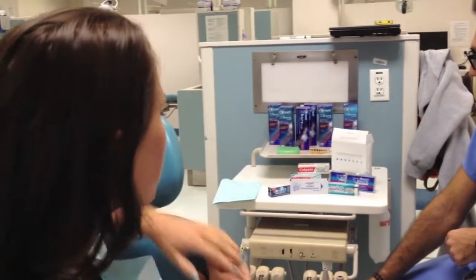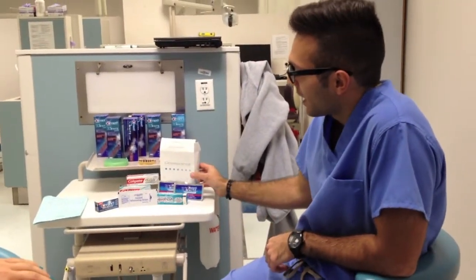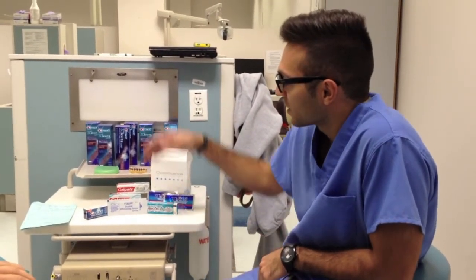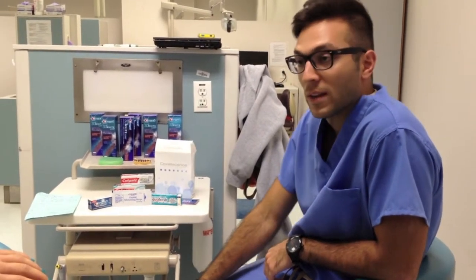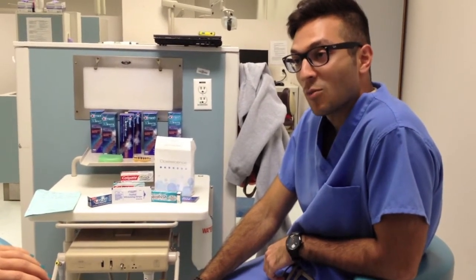I've used the middle one before. It didn't work. Well, what we have here is a tooth whitening home system. It involves a custom tray, which you can apply this solution to at night or during the day. And it offers some great results. Would you like to hear more about it?